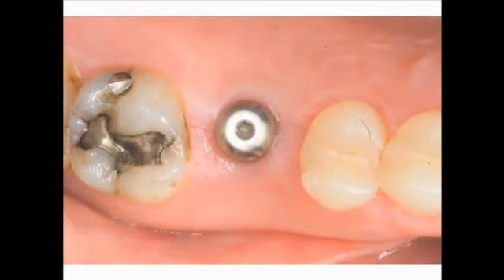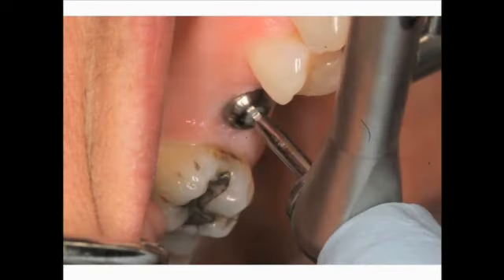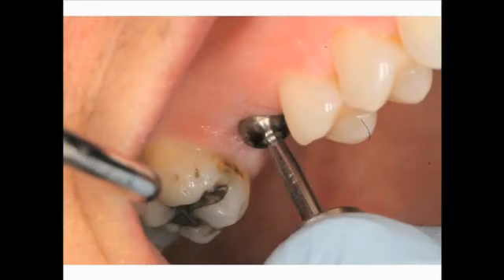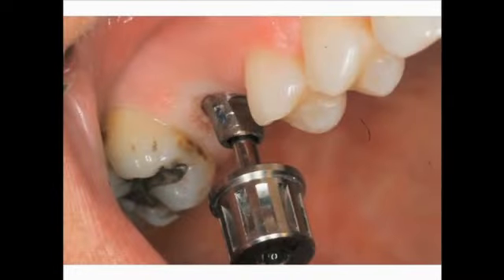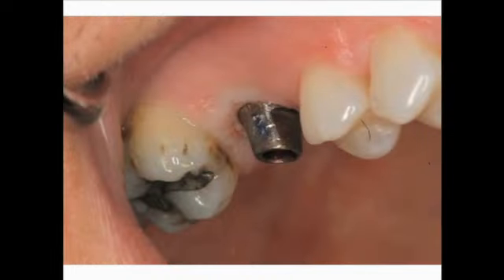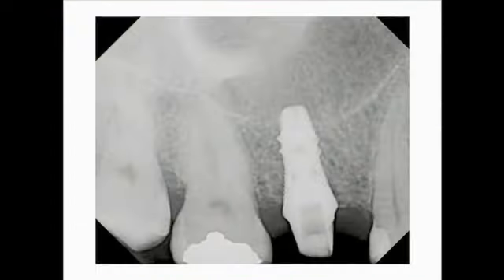Again, the healing abutment, you can see the tissue around the healing abutment, and we will remove this prior to placement of the prepared abutment that the laboratory created for us. So we're using our hex tool to remove the healing abutment. Here, the prepared abutment is torqued into position at 25 Newton centimeters, and a radiograph is taken to ensure complete seating of the abutment into the body of the implant.